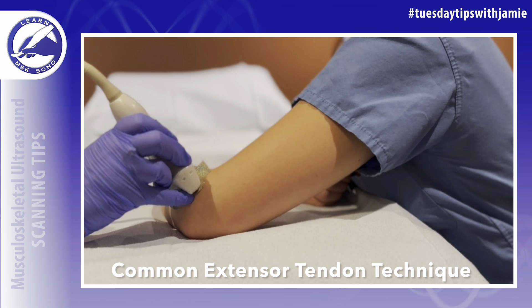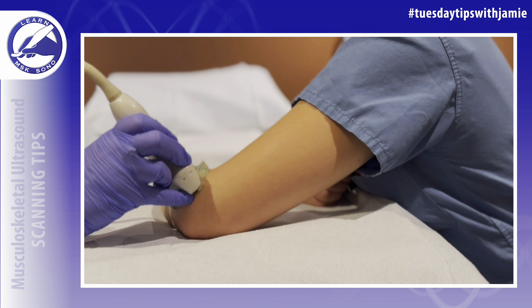First, locate the common extensor tendon when imaging any of the structures of the lateral elbow compartment, because it's easiest to recognize. This is your landmark and home base for scanning the lateral compartment of the elbow.